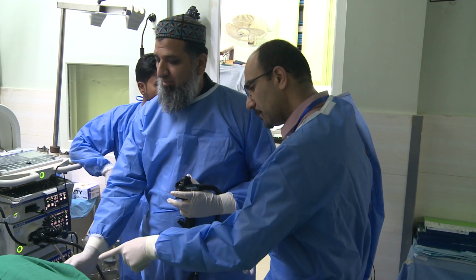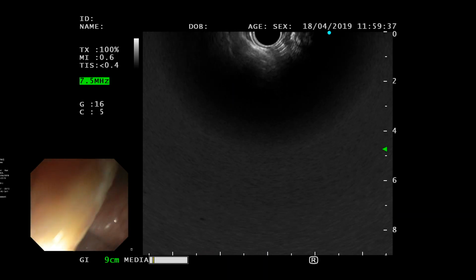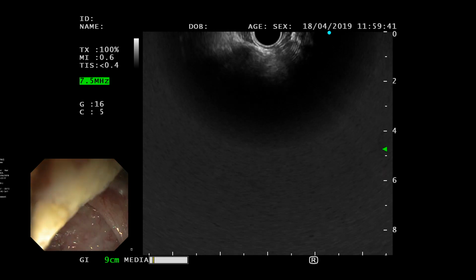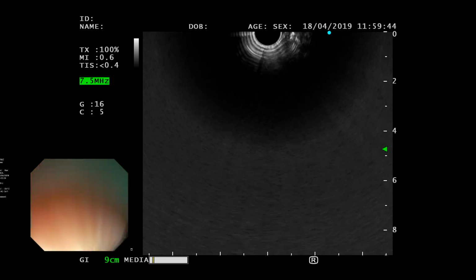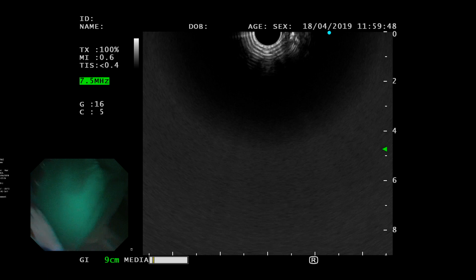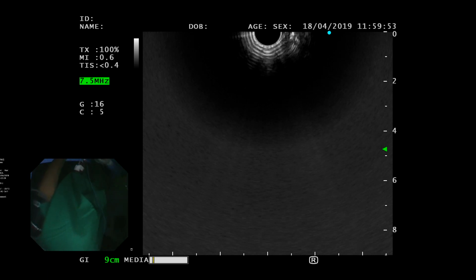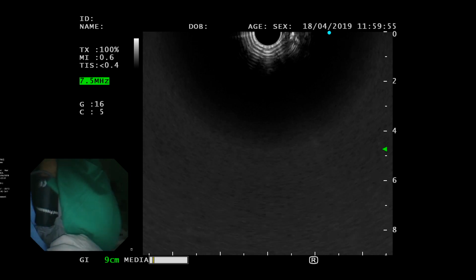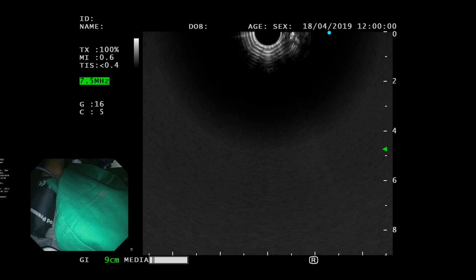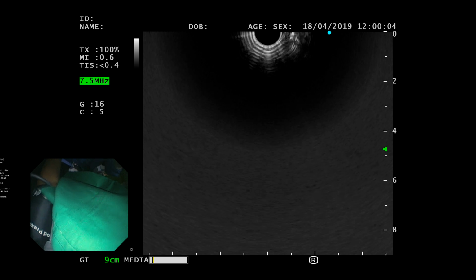Hold it a little closer. You're too far. 25. And just think of it like an ERCP. I wouldn't overthink it. Careful, careful, careful. Hold it like you would for an ERCP. Firmly. Thumb a little down. Just enough to get you over the tongue. Once you're over the tongue, you basically advance. You can slightly advance. Relax your big wheel, and it'll just go in.